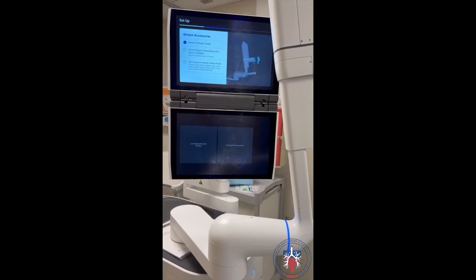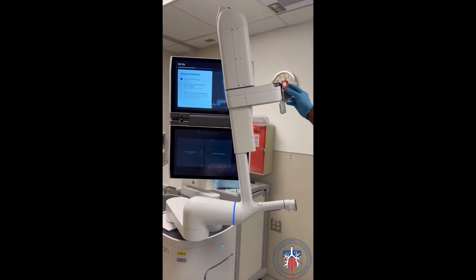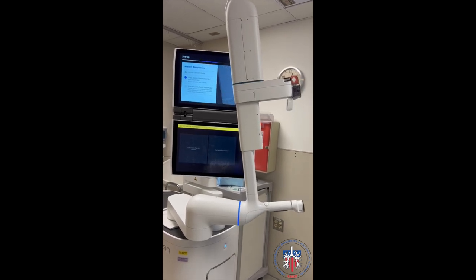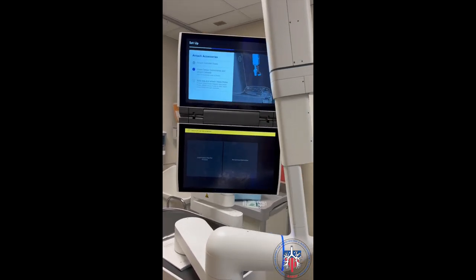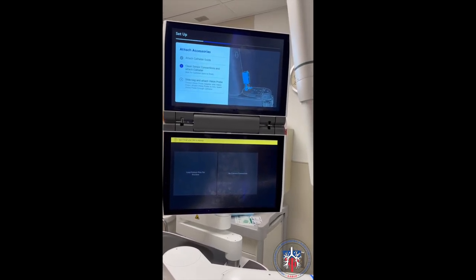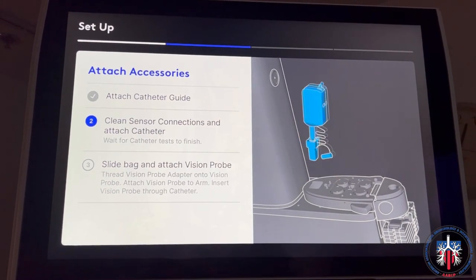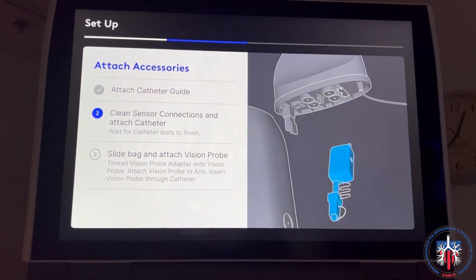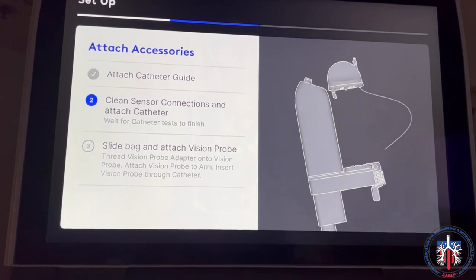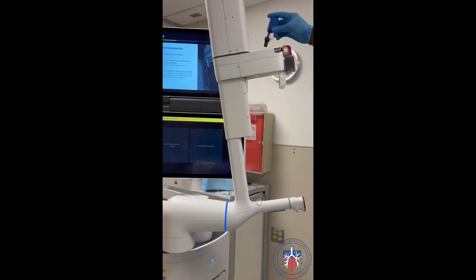Following instructions on the monitors, attach the catheter guide to the robotic arm. The system auto-detects the correct completion of a step and will then provide the next setup for the process. The sensor connections are cleaned at least 3 times each on the arm carriage sensor port and catheter center port. This step is shown here.